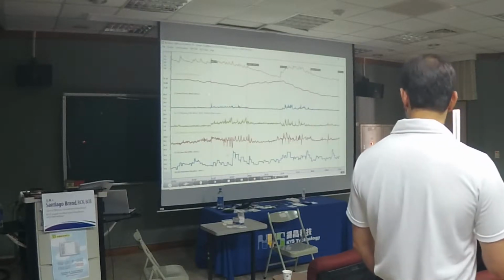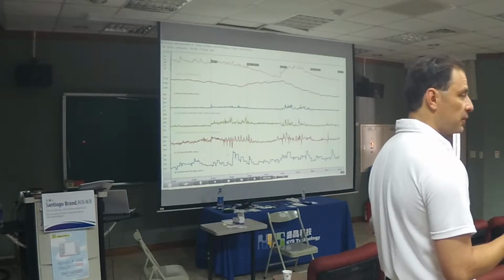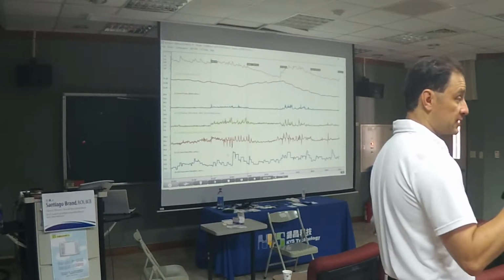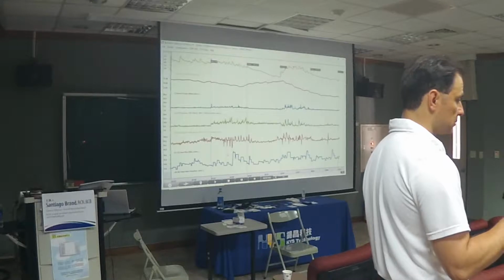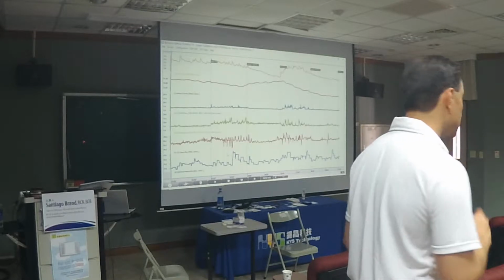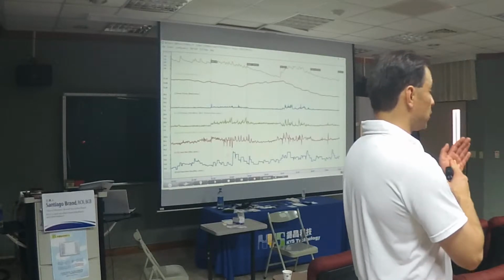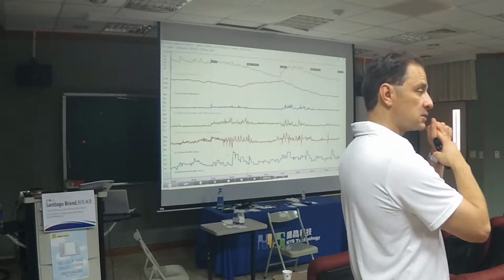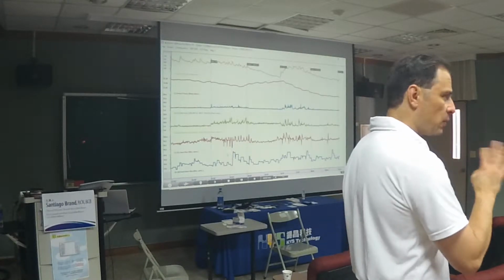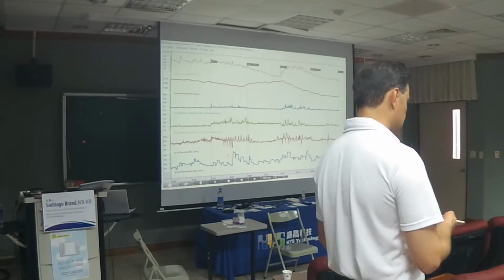Okay. Now the ideal value is between 31 and 33. That's acceptable for males and females. If you can go higher, close to 36, 37 Celsius, that's even better. Okay. Now remember, this is not the core temperature. This is the peripheral temperature. So this is not the type of temperature your doctor measures when you're sick, or when they want to check. It's blood flow to the periphery, the arms and hands. Okay, the arms and the legs, sorry. But 31, 33.